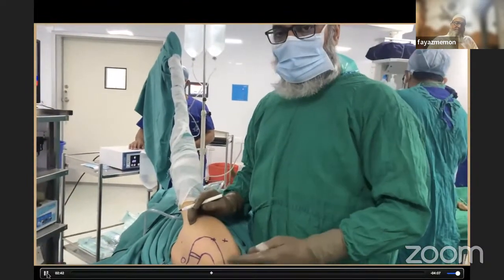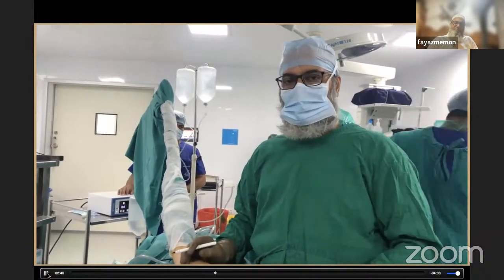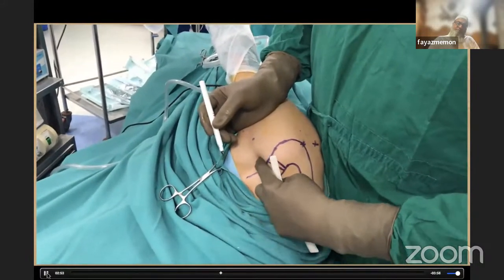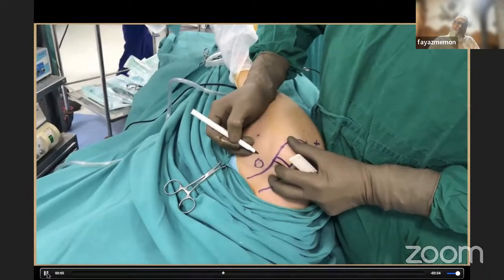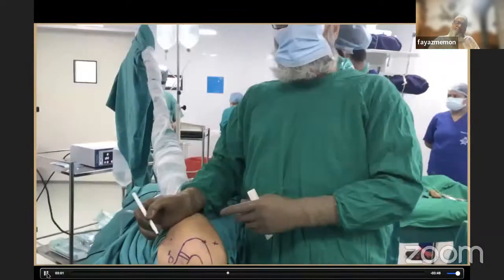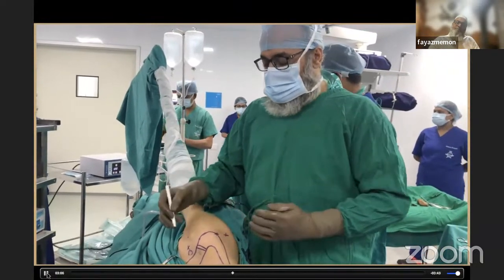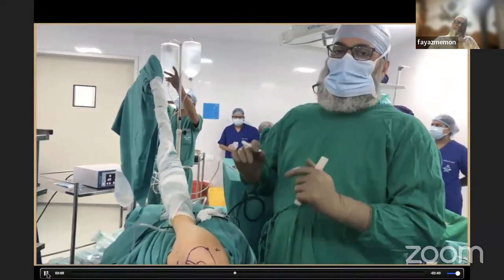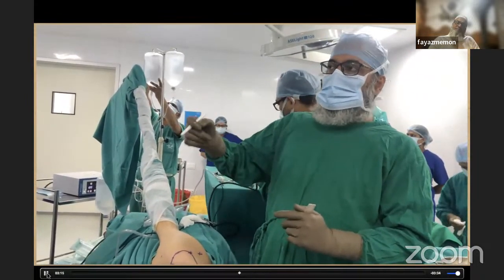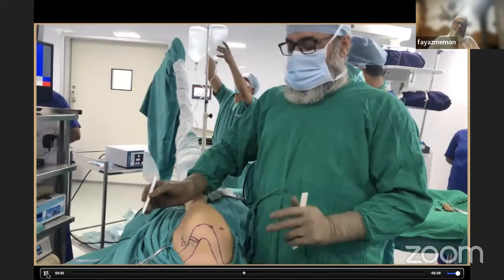Then in case I am doing a Bankart repair, say, so it is going to be a glenohumeral joint procedure. So the next one that I do is the anterior portal. This is going to be a little lateral and a little inferior. I'm marking it here because once the joint gets inflated, maybe the bony prominence might not be seen. However, whenever you are doing the arthroscopy, you visualize it from inside, palpate it with your finger, and then put in a needle, and then take the portal. Remember that here you are very near to the subclavian artery. So one has to be very careful about that.